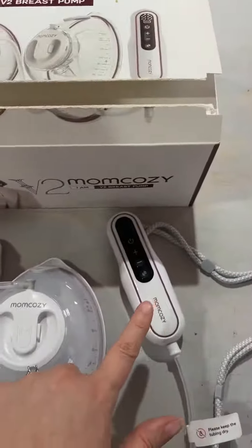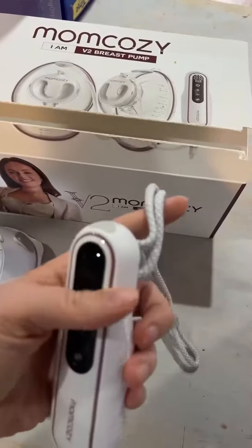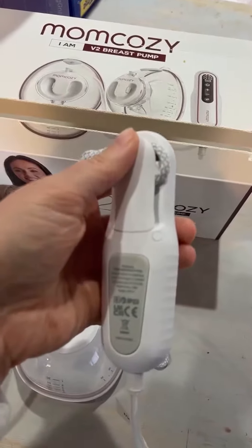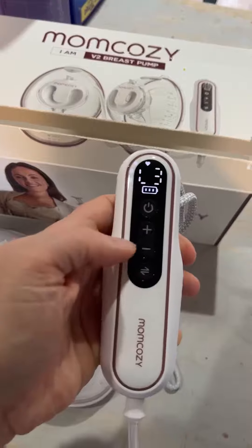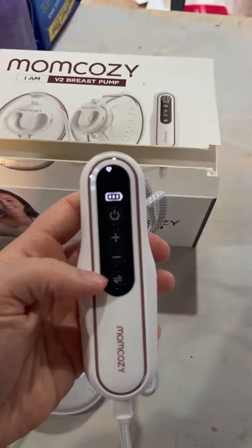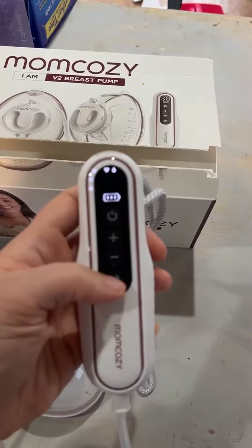This is the control that it actually comes with — very easy to use. You can carry it around with you, or there's actually a clip in the back where you can snap it into place. As far as settings are concerned, you have the on button. Once the on button is on, it gives you the option of increasing suction or decreasing suction. It gives you the mode as well, so you can choose between lactation or stimulation.